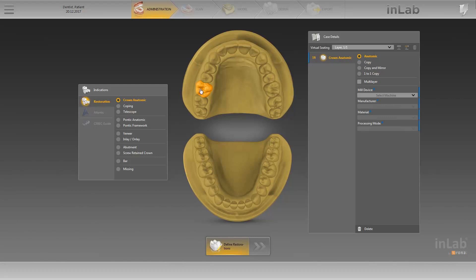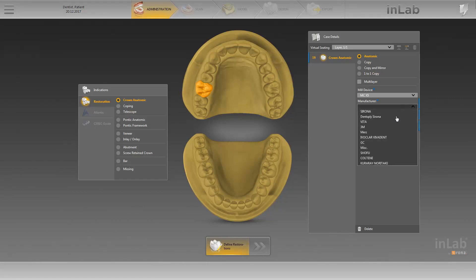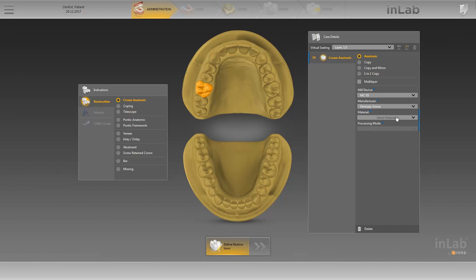Now we'll go through this step-by-step. Under Mill Device, we define the machine on which the restoration is to be manufactured, and as soon as this is selected, the blue indicator disappears on the right-hand edge. Next, we specify the manufacturer of our material, and select an appropriate material from this manufacturer. In our case, this is Seltra Duo.